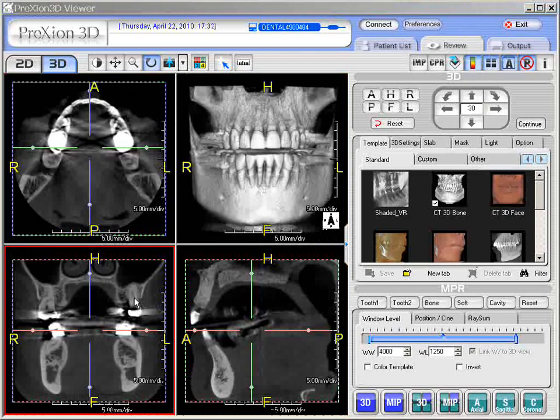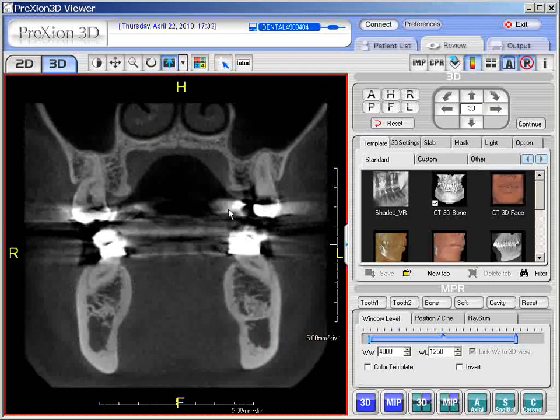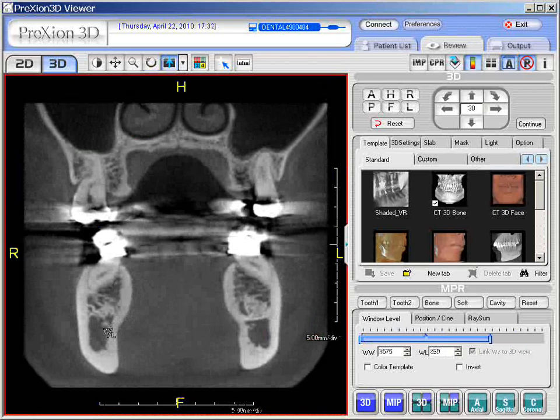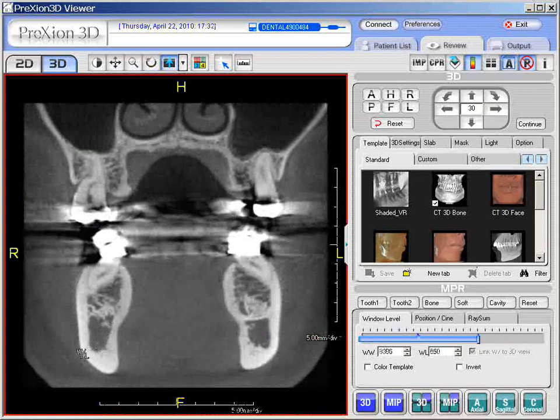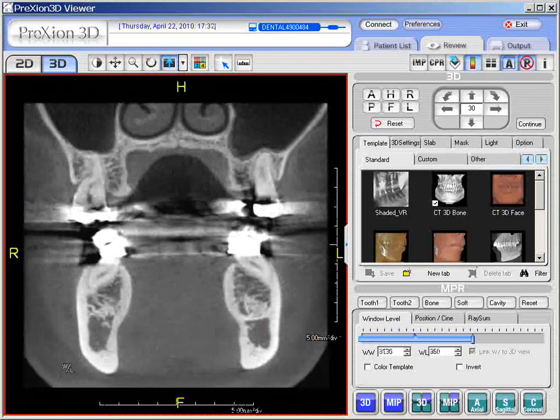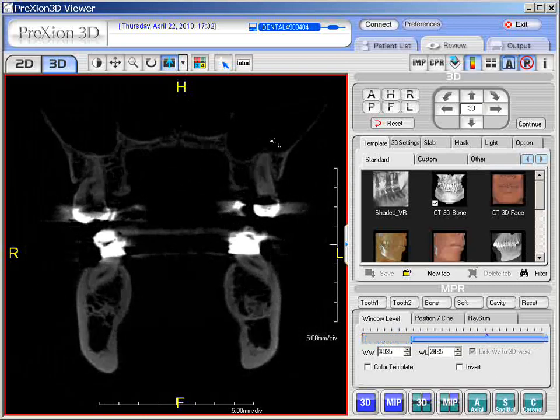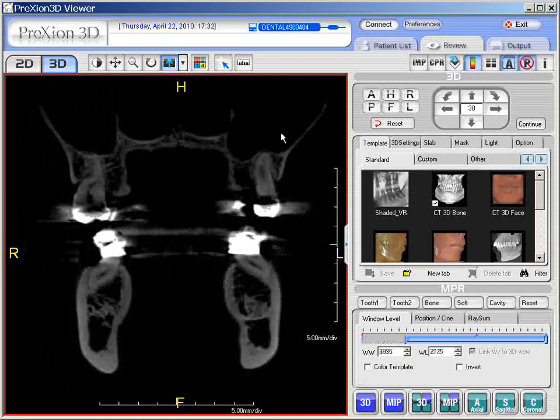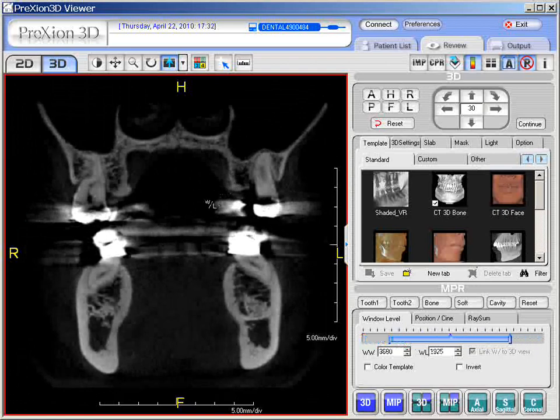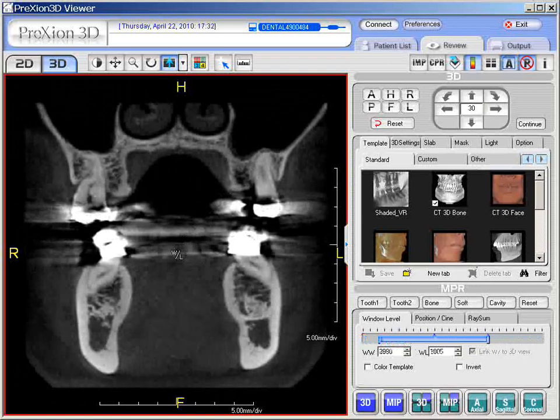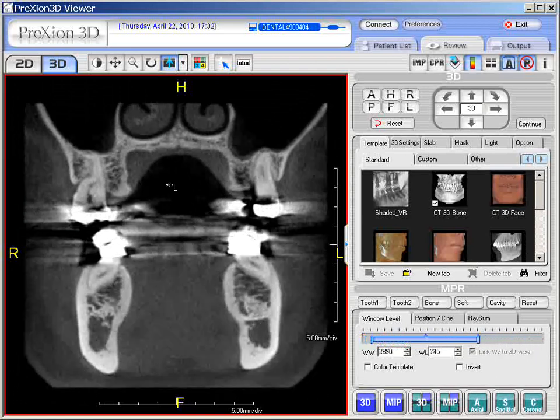The same applies to the CT screen. To adjust the window level, hold the right and left click mouse together. Moving toward the southwest fills in more of the lower-level softer tissues, while moving toward the northeast corner removes some softer tissue. Make sure you maintain a soft enough window level so you can see the soft tissue and ensure you're not missing anything.